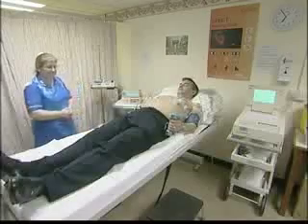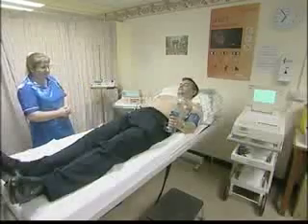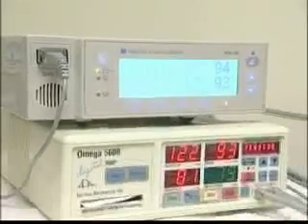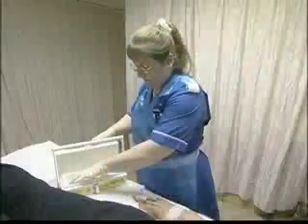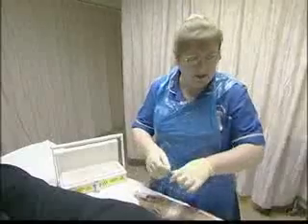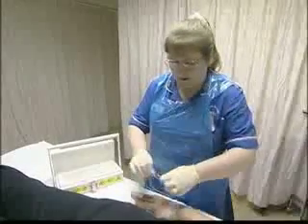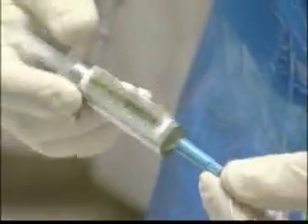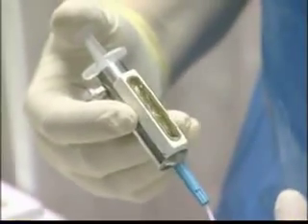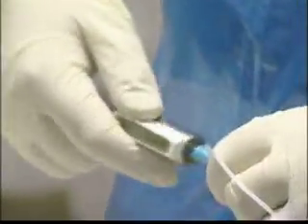The heart needs to be monitored carefully during this period so an ECG is recorded. This is the bit that allows us to take some pictures and see what's going on. Once the heart has been stressed the radiopharmaceutical is injected. In this case the pharmaceutical being used is technetium labelled tetrafosmin.